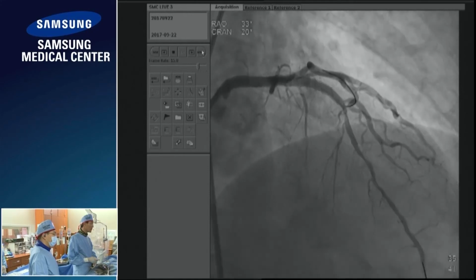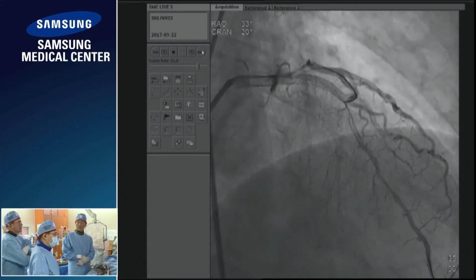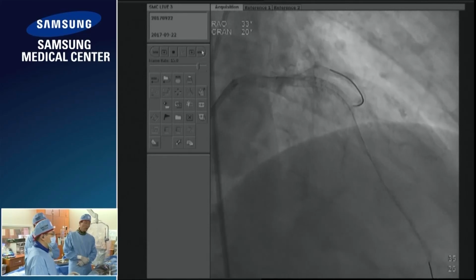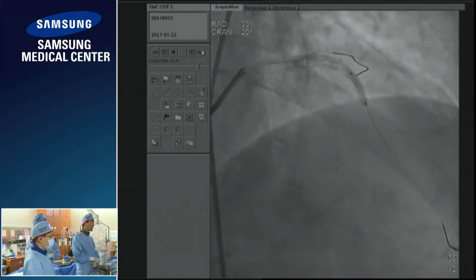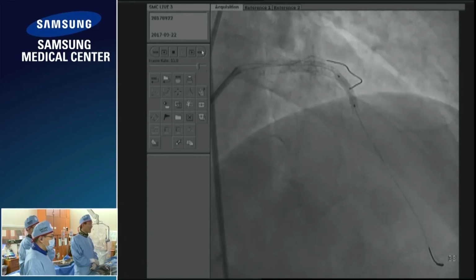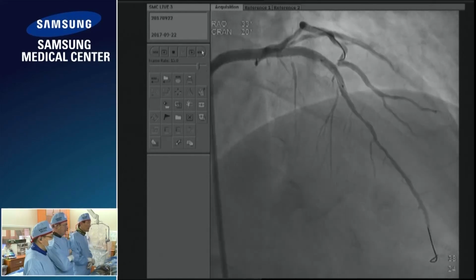Okay, you can see some stenosis just distal to the stent. It looks like hematoma or some narrowing, spasm, but OCT clearly showed us that this was an occlusive dissection. So we had no other choice but to implant another stent. Next. So this is a 2.5, 15 millimeter stent again. Next. And again, deployed with 8 atmospheres, low pressure to avoid the dissection, and pulled back with high pressure. And fortunately, the diagonal survived even without the jailed wire.